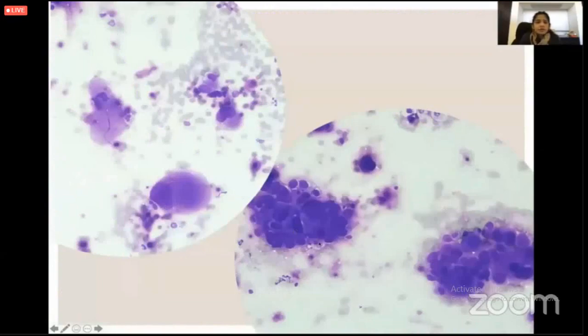Let's look at the cells more closely. Look at that humongous big cell. It's single, but it's trying to form a cluster. In Australia, if we see something like this, of course, we think, could it be a melanoma also? Or is it an anaplastic because it's a thyroid we are looking at? But it's trying to form clustering, so melanoma goes down in the list. Maybe it's a poorly differentiated malignant tumor, which has a discohesive population of cells as well. And of course, I can't see any inclusions or anything like that.